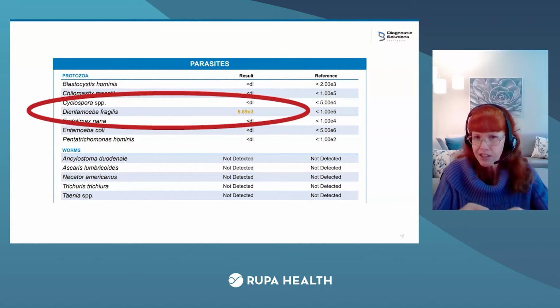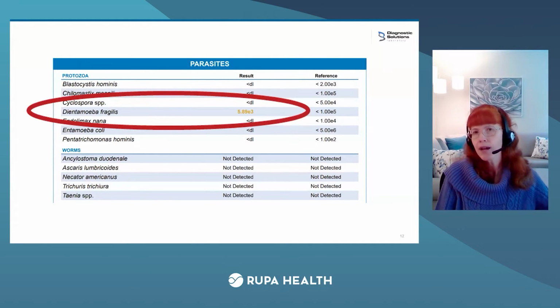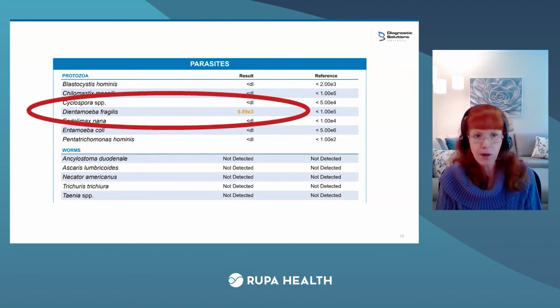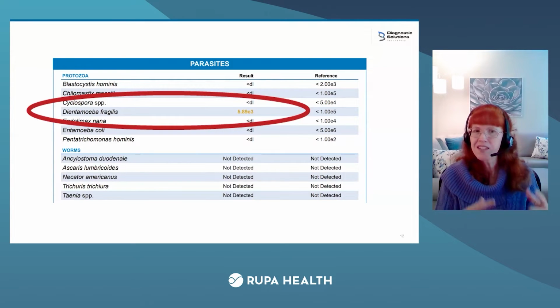Now, again, connecting the dots, remember back to Faecalibacterium on page 2 that was low. Maybe it's low because you're not feeding it. It's a fiber eater. If you're not eating a lot of fiber-rich plant foods, it's just going to starve. But it also hates inflammation. That's like the canary in the coal mine when it comes to inflammation. What's hanging out in that same vicinity? This pro-inflammatory parasite. So this is what I see sometimes where Faecalibacterium is low and you get the patient's history and this makes no sense.